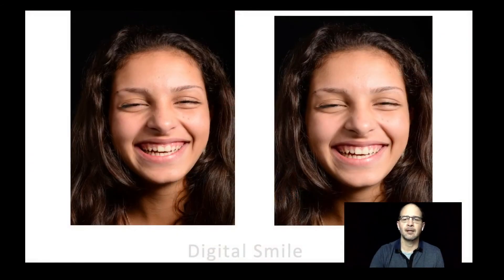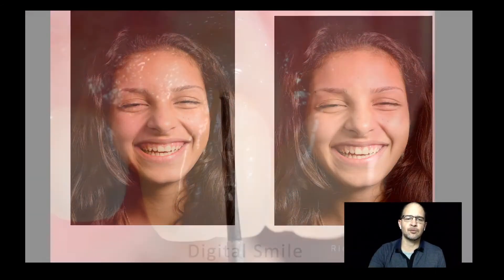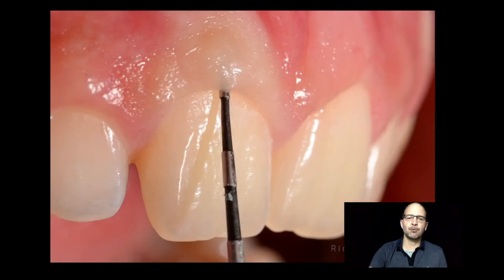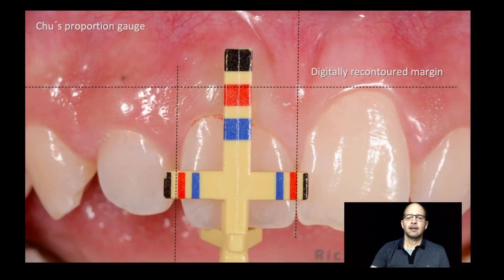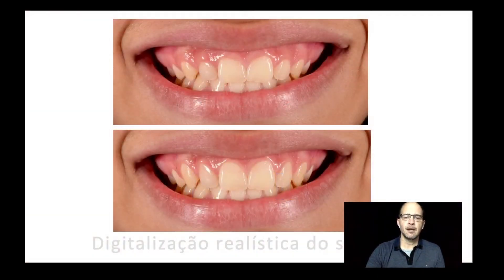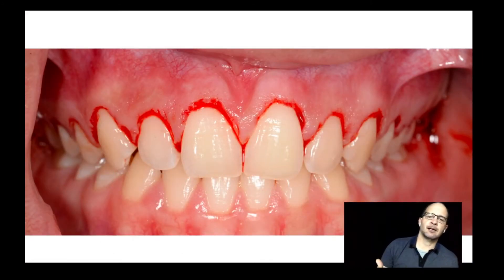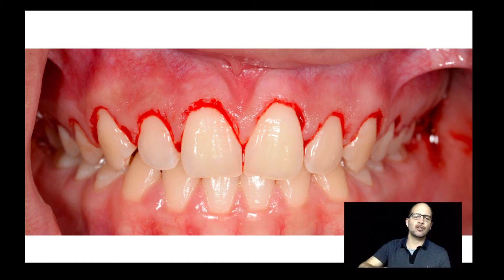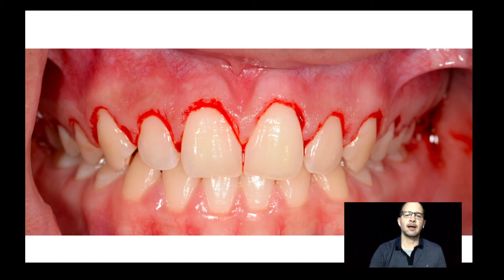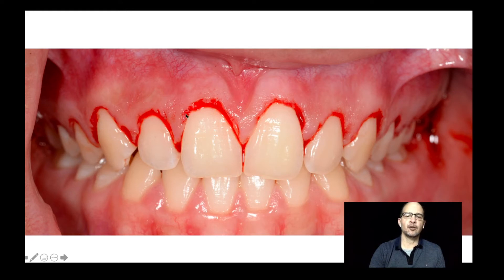You don't need a lab to do anything. So you can do some digital smile, check probing, of course. Here is the usage. And then, following this gauge, you just perform your incisions. I know my incision here was performed by a student, but it's really well done. Follow the proportion — see how the proportion of your lateral incisor with the central incisor is already in place.